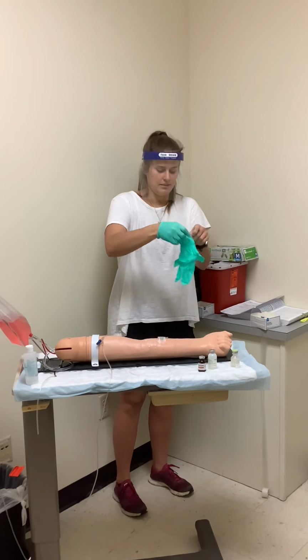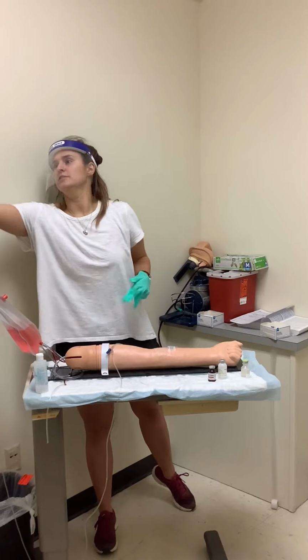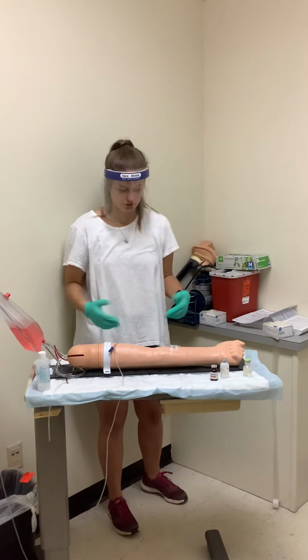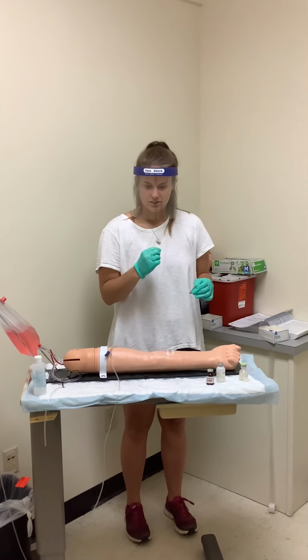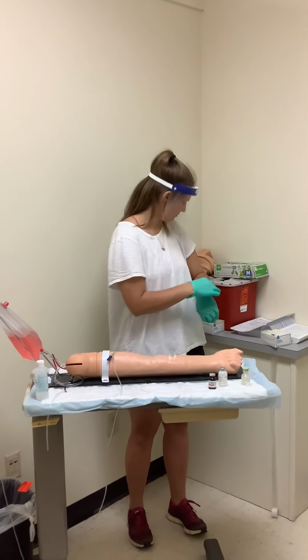I'm checking the medication that is running, which is the normal saline, which we have already checked is compatible with the medication that we are giving. And now I can check if they have any allergies. Do you have any allergies? No? Perfect.